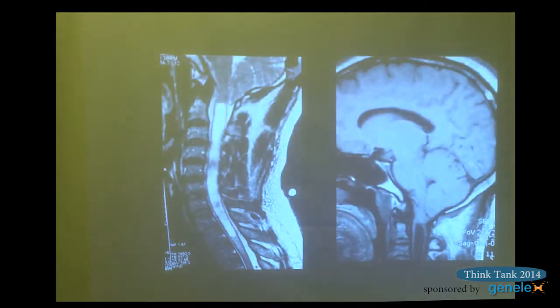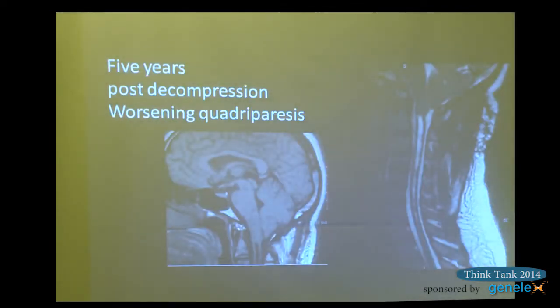He had decompression. Oh, this is same business. He ended up having decompression, but the syrinx hasn't really gone away. There's still an element of impingement, and he's got worsening quadriparesis. He wasn't really interested in having surgery at this point, but had still come around asking for an opinion.